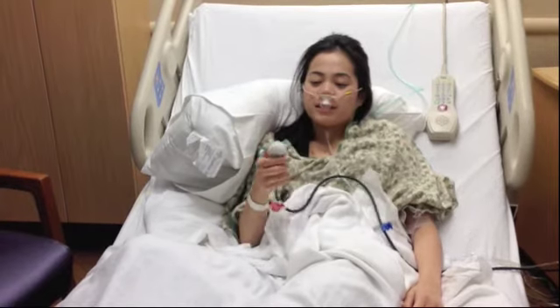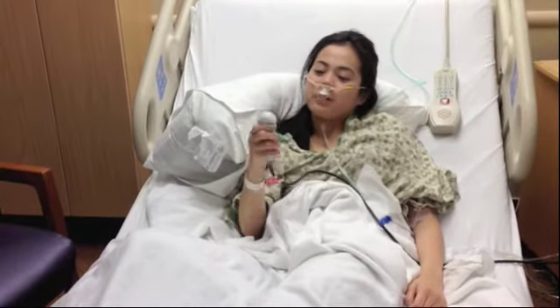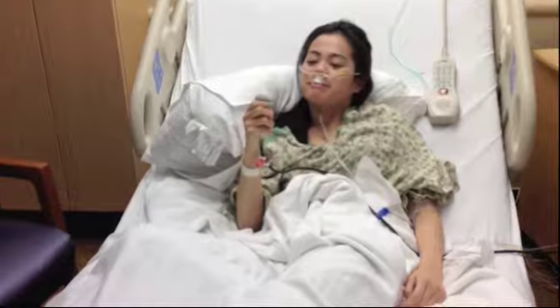Oh, that felt so good. I'm going to press it again. One more. Maybe one more time.